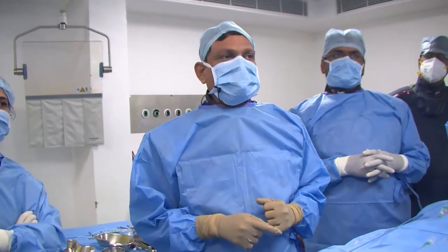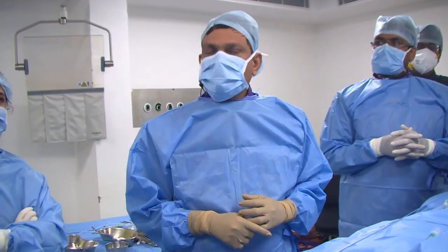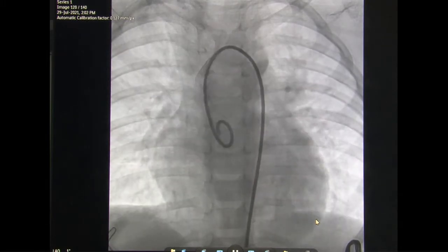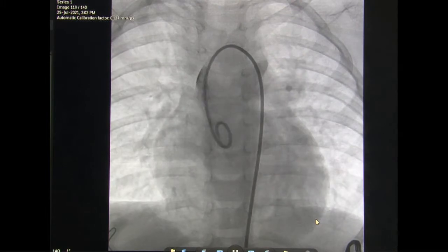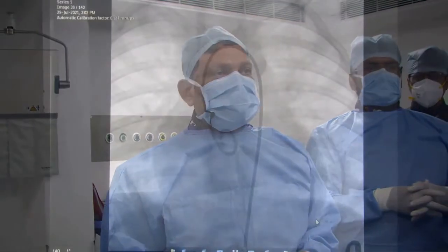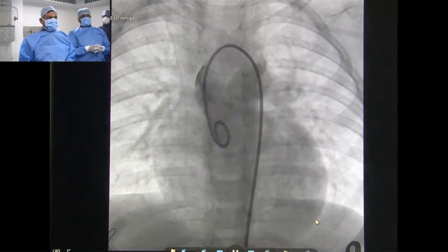Show the first angiogram. Yeah. You can see this is the AP view using the pigtail catheter. You can nicely see the fistula which is going through the AV groove and then to the coronary sinus at its opening into the right atrium. There is a left coronary artery we can see nicely. We can't see OM branches from the circumflex artery here. So next.